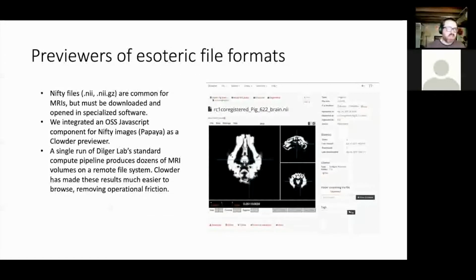The second thing that they need to look at is the final cleaned up MRI image to see if it's rotated and scaled and centered correctly. This is also something that they can really just glance at. They know right away if this is right or not. They just need to be able to get to the information and have it all in one place.